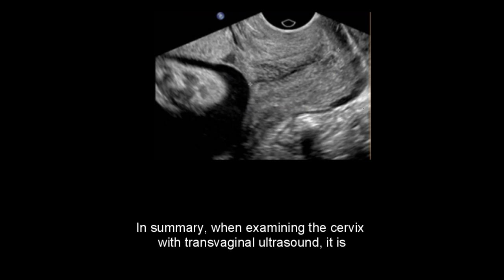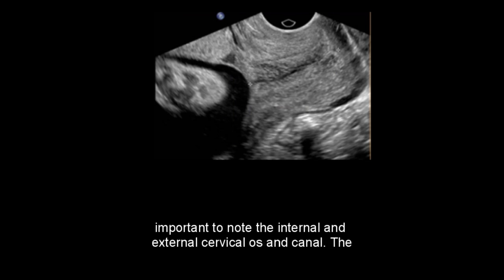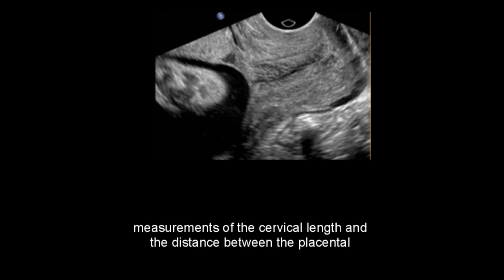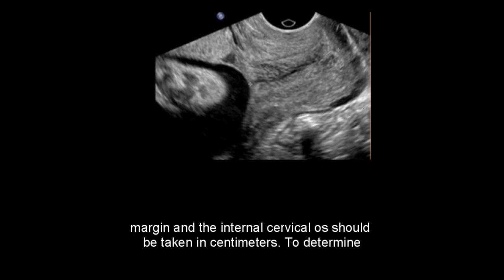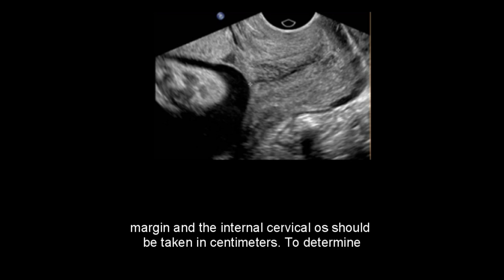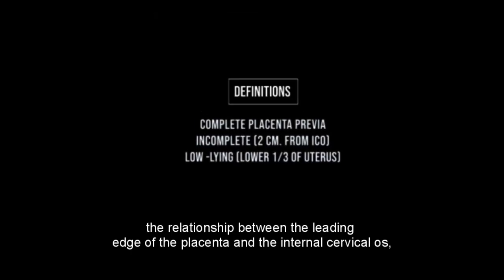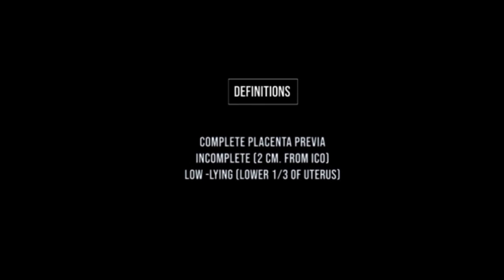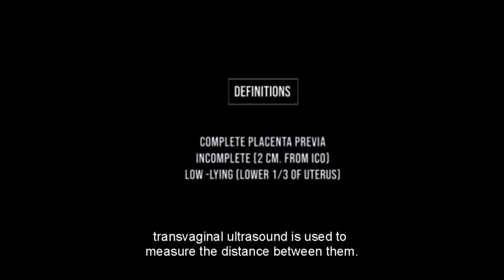In summary, when examining the cervix with transvaginal ultrasound, it is important to note the internal and external cervical os and canal. The measurements of the cervical length and the distance between the placental margin and the internal cervical os should be taken in centimeters. Transvaginal ultrasound is used to measure the distance between the leading edge of the placenta and the internal cervical os.